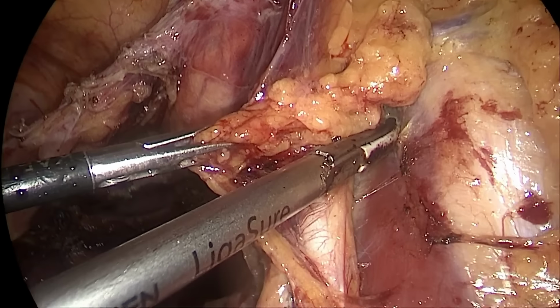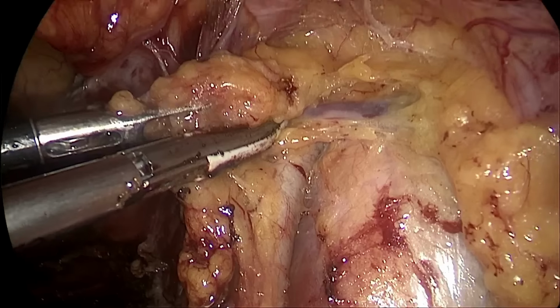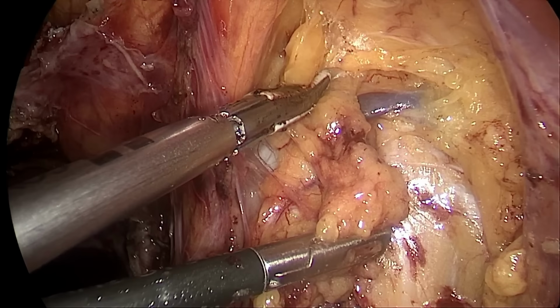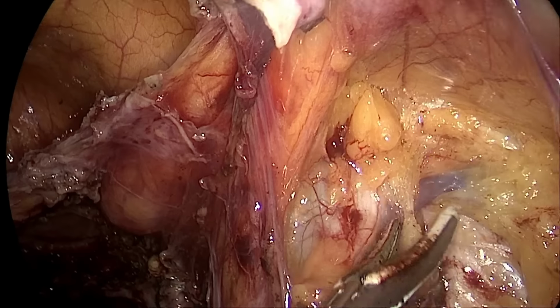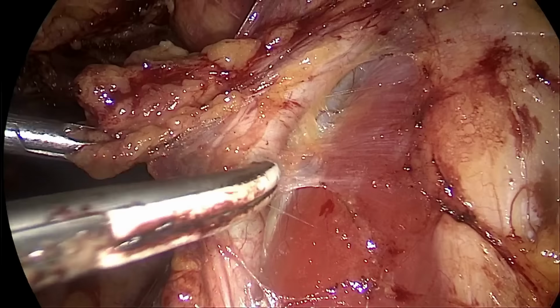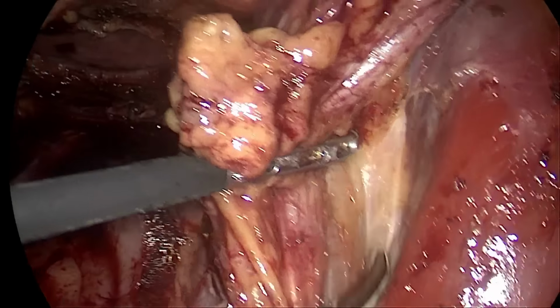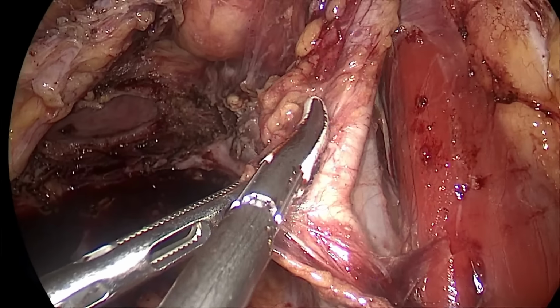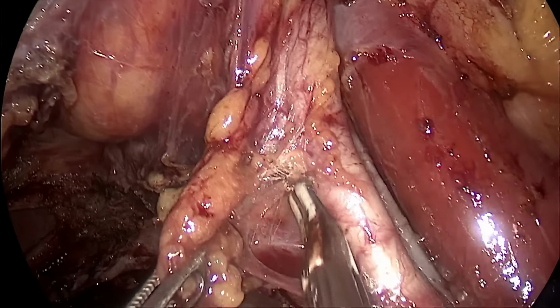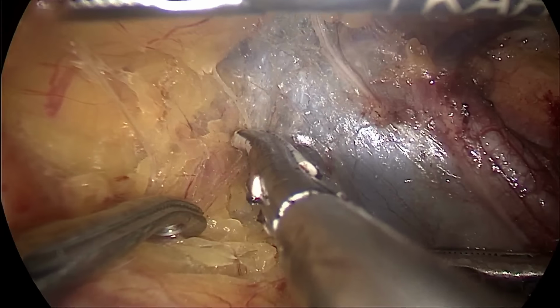After that, we are separating vessels from the psoas major muscle. Superiorly, you can identify there is a node above the deep circumflex iliac vein, so that is being incorporated in the specimen. So there are two techniques of pelvic node dissection. One is medial approach and one is lateral approach. So if you go with the lateral approach, that is dissection in between the psoas major and the vessel, then all the lymphatic tissue will be taken up in the specimen.